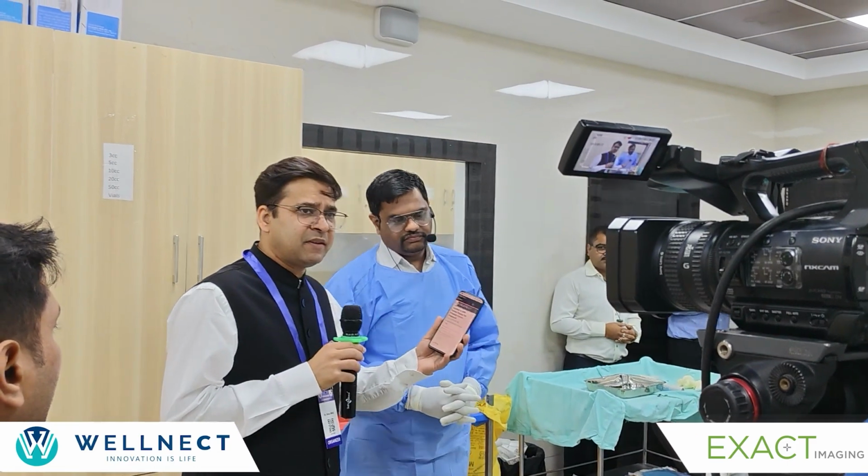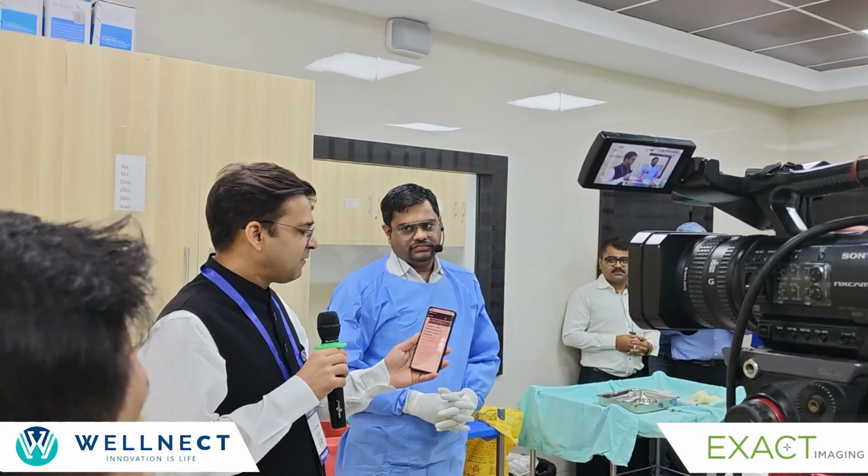Yeah sir, there is a trial, an optimal randomized trial, which was published, and I should say the literature is still not mature enough to comment on anything. I think this is a training session, so we should convey what we all need to. Gupta sir is there, and we are all here. The first thing is to learn about all the armamentarium which are available, which are about to come, and which are in place. The difference and how it is seen in both the systems is our logic today.